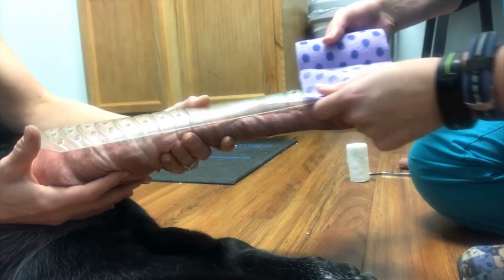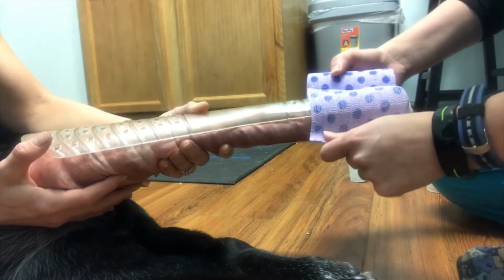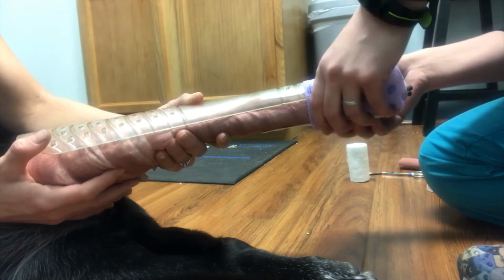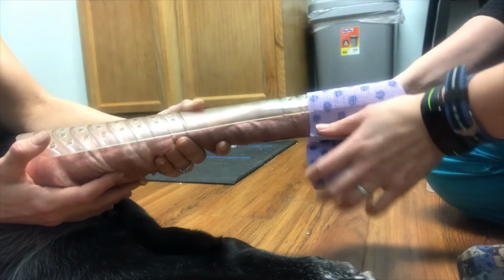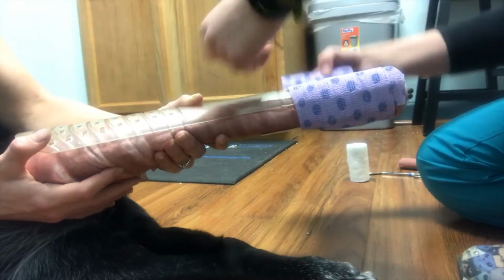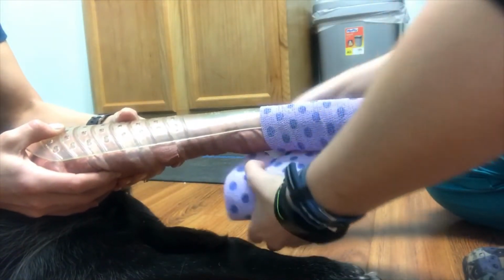There again, I'll start at the most distal aspect, making sure that there is a strip of cotton between the vet wrap and the skin, as the vet wrap is constrictive. So I'll pull it out and over, and I'll lay it across the top, and on the bottom, pull, lay across the top.